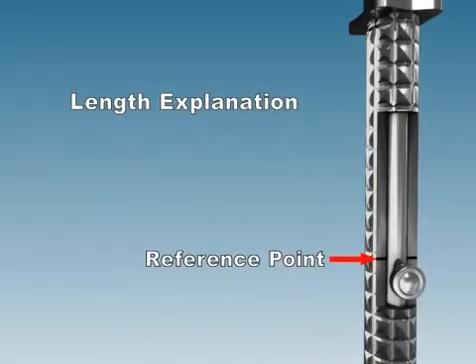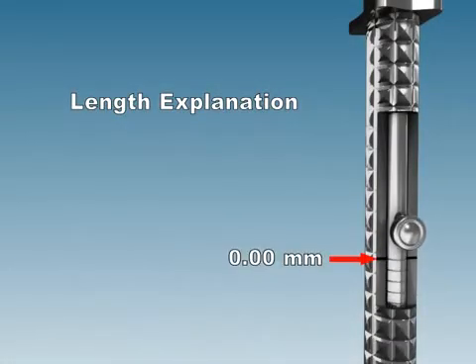The first notch displays a measurement of 0 mm, the next one displays 1 mm, and subsequently. After 4 mm, the divisions on the moving slider are of 0.5 mm.